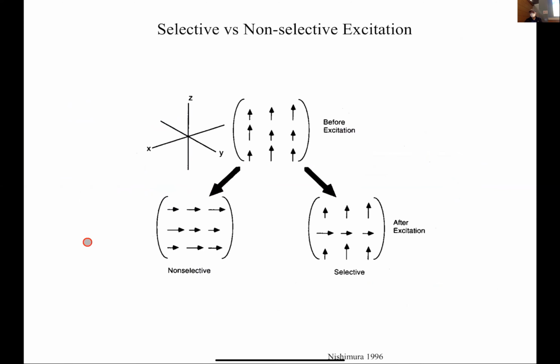But when MRI was first developed, and still to this day, it's very common to do what's called 2D imaging, in which case you just want to excite a slice. Therefore, we want to find a way that we can excite a slice within some bandwidth, some delta z.